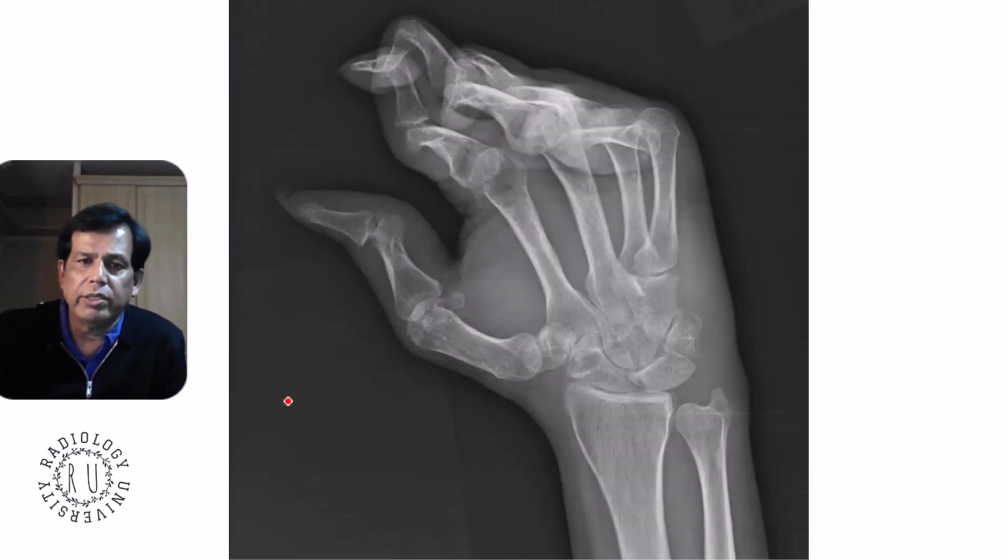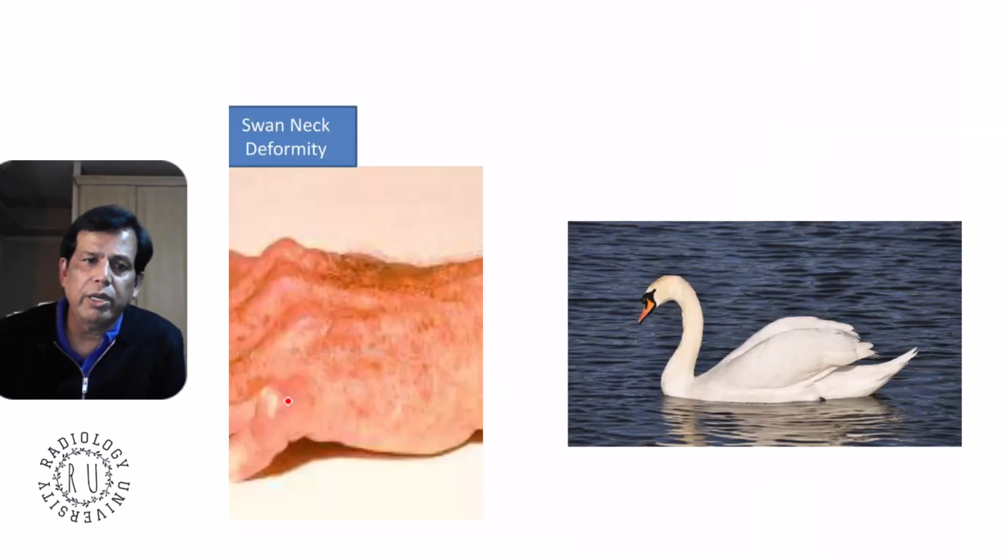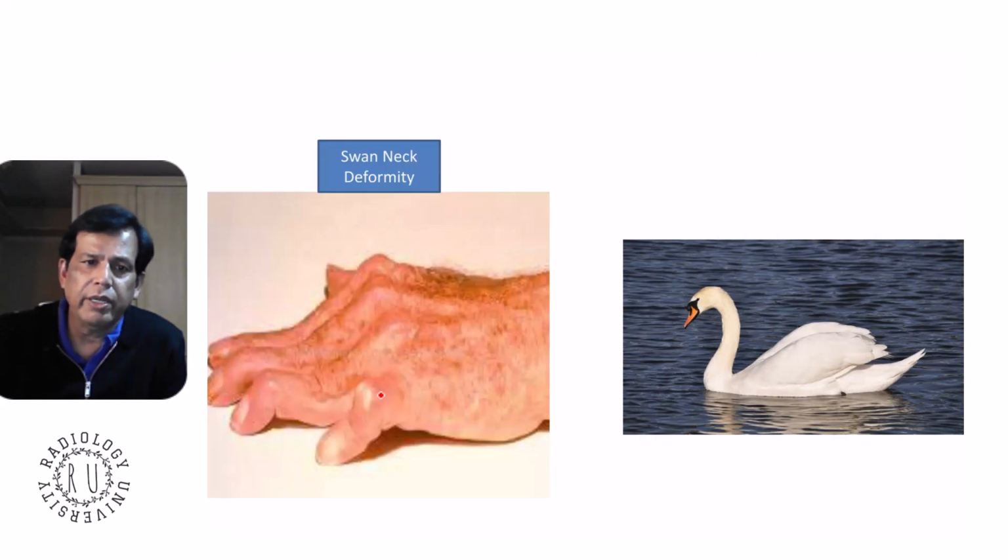Again, a similar picture, and you can see how the clinical picture looks here. Exactly: flexion, extension, flexion.